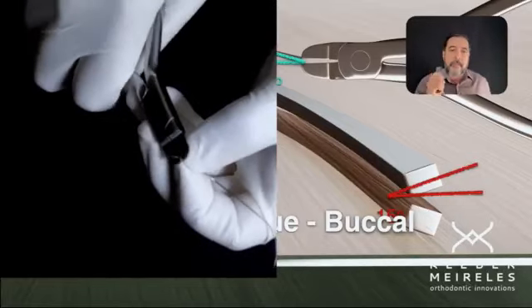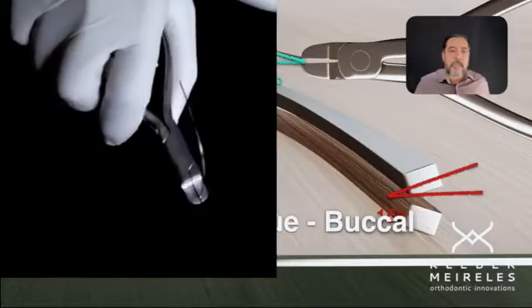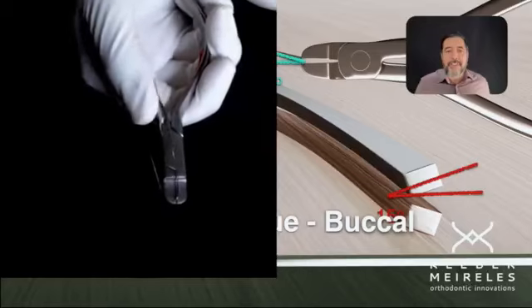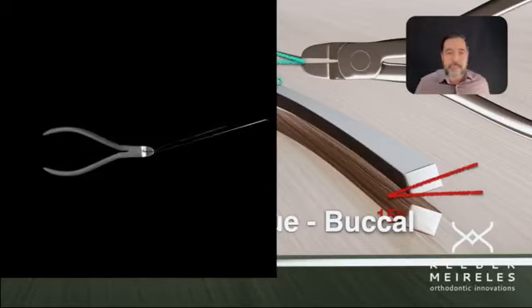Okay, and this is the way I apply the torque. You know that we've seen that before, and you need to practice. Please do that.